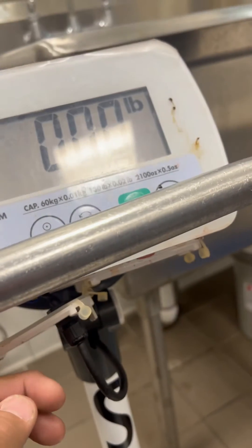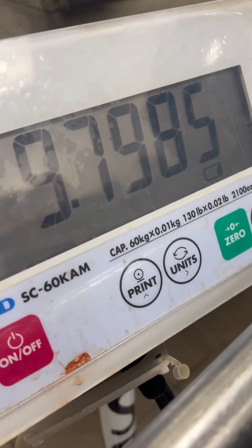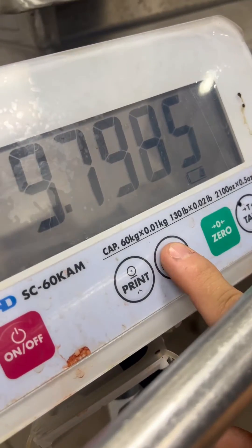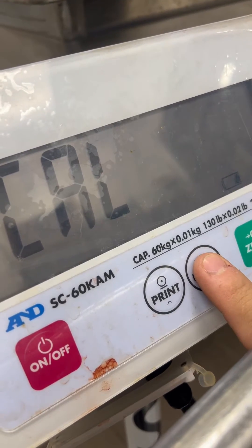Press it once — that's your gravity digits. Press the units key, which brings it to CAL. Then press and hold down the units key.